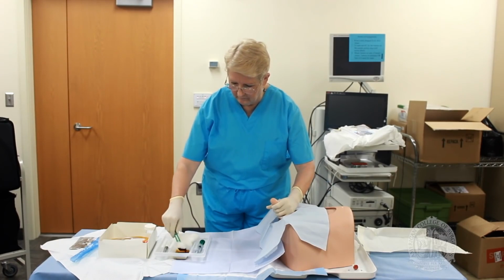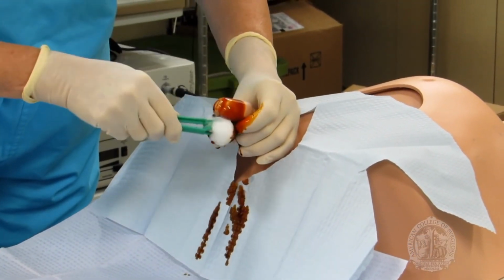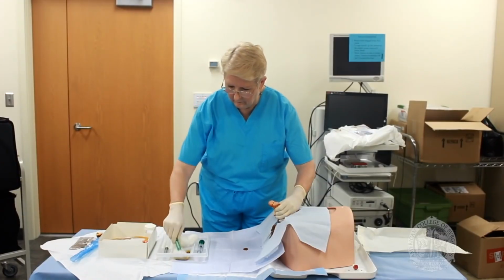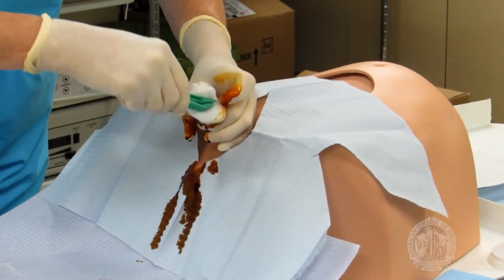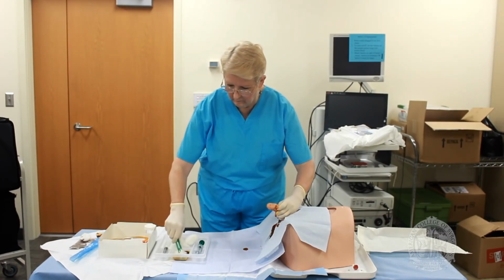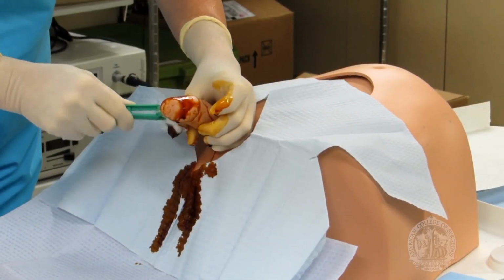Hold the shaft of the penis in your non-dominant hand, retracting the foreskin if it is there. If you are using your left hand to place the catheter, stand on the patient's left side. Your non-dominant hand is now contaminated and cannot assist in placement until the catheter is in place and the balloon is inflated. Pull up on the penis. If your grip is not tight enough, placement will be difficult and can lead to unsterile placement.